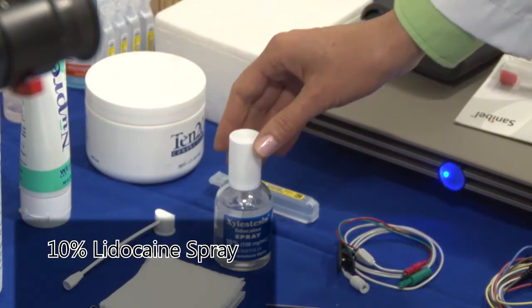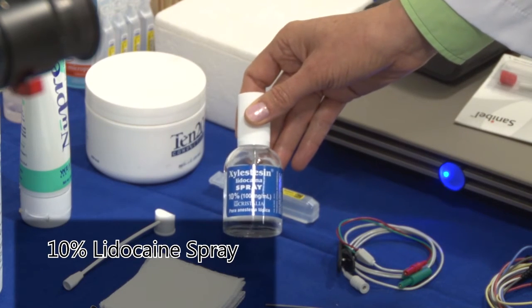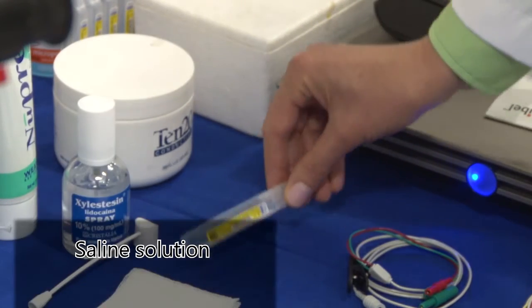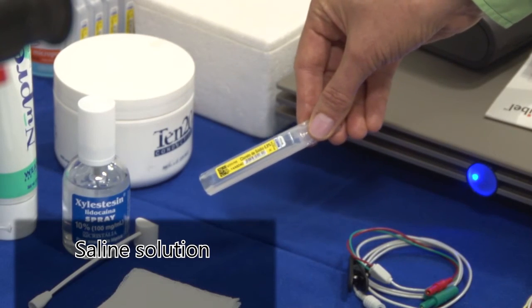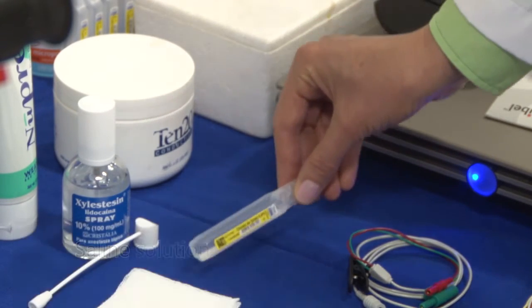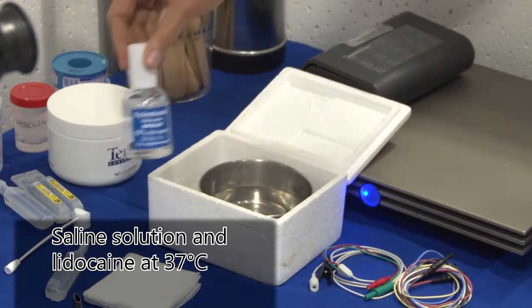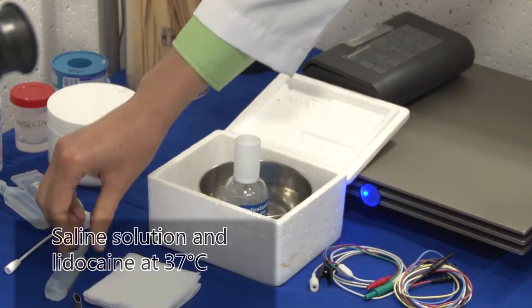We like to use topical anesthesia with 10% lidocaine spray. We also use saline solution to improve electrical conduction. As our patients usually experience dizziness, we use lidocaine and saline solution at 37 degrees Celsius. It is much more comfortable for the patient.